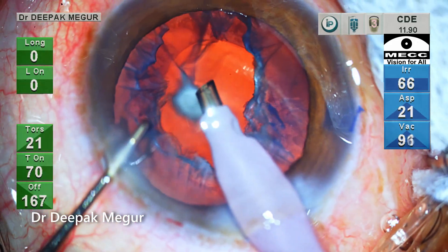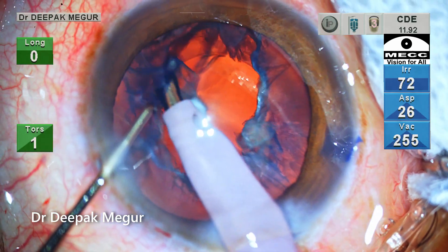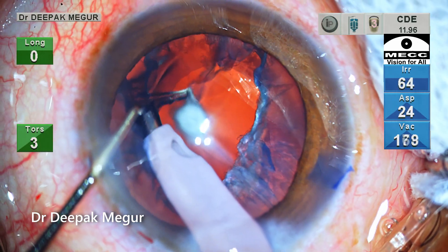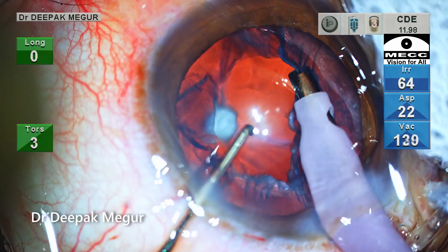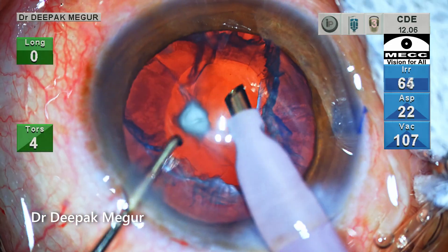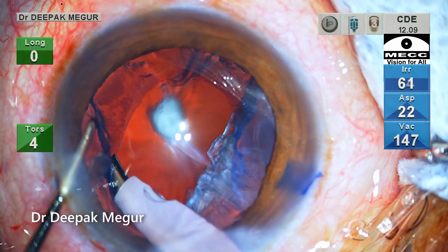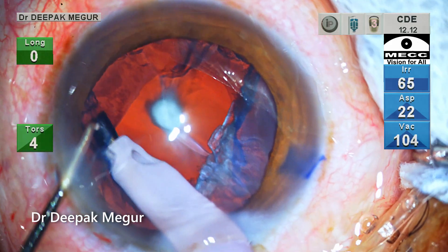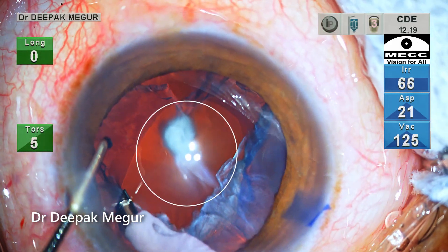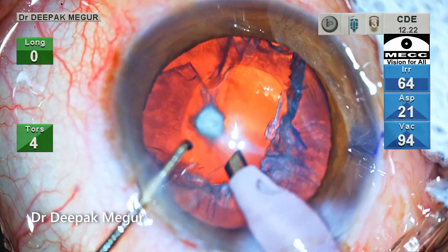Now time to remove the epinucleus and the cortex. There is a principle to be followed here. I would delay the aspiration of the central part of the epinucleus and cortex complex and keep it for last. The aim is to first deal with the peripheral aspect of the epinucleus and cortex, try to strip them to the center repeatedly, and in the last deal with the central portion, which obviously will be the weakest part of the posterior capsule.